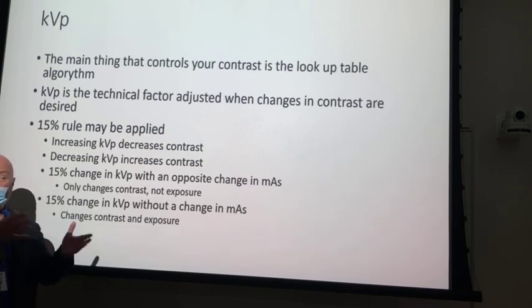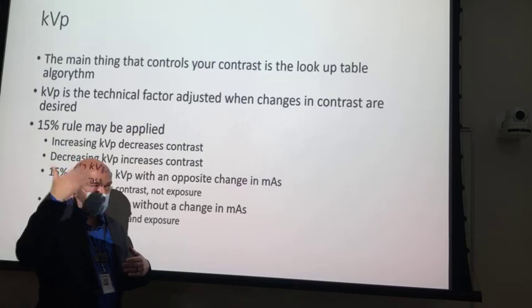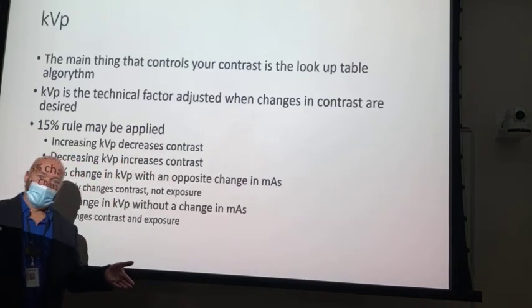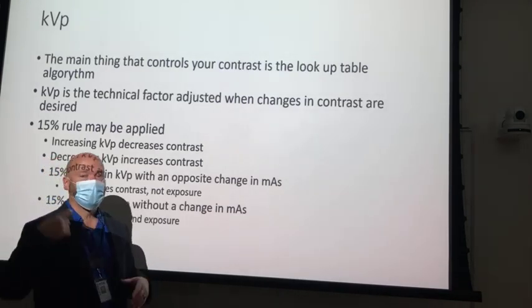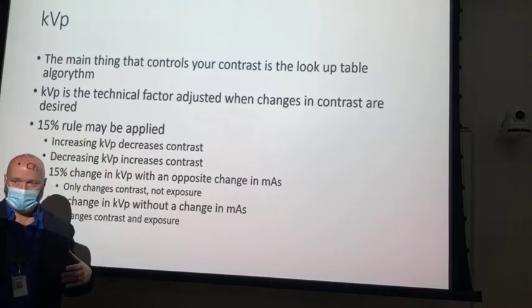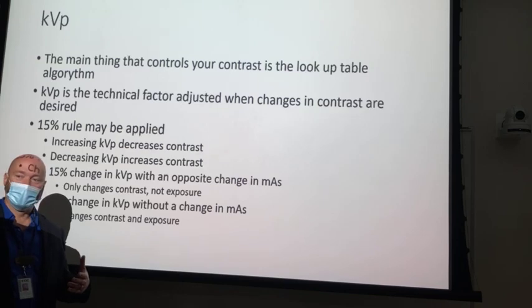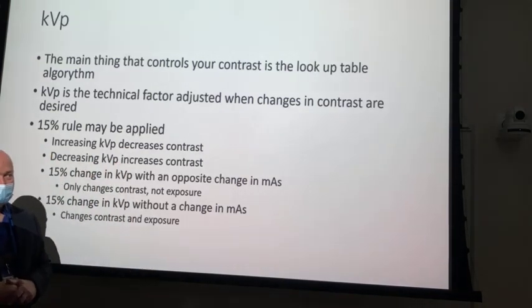Probably by a factor of 4, because what's the general rule? Cut it in half. As you increase your kVp, you fix the penetration problem. You cut your mAs in half, and that brought you back to your original exposure, but your original exposure was too high. So what's your general rule? Cut it in half. So you increase your kVp and cut your mAs in half a second time.